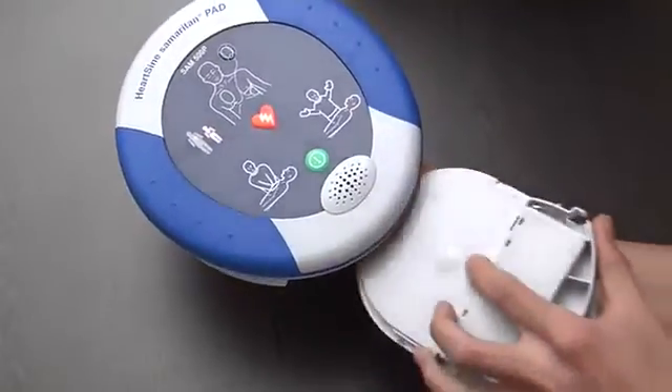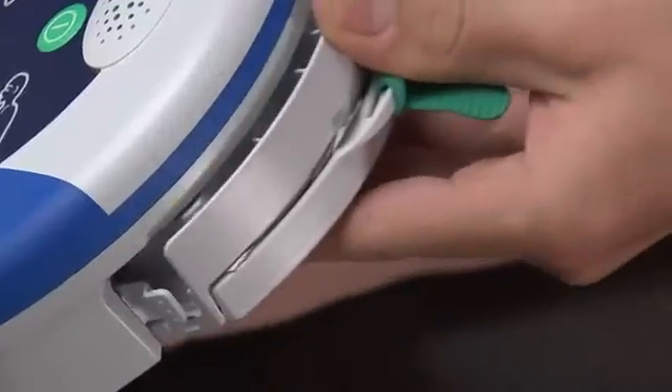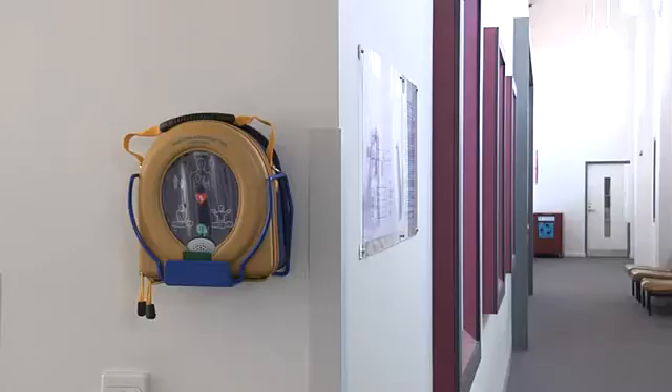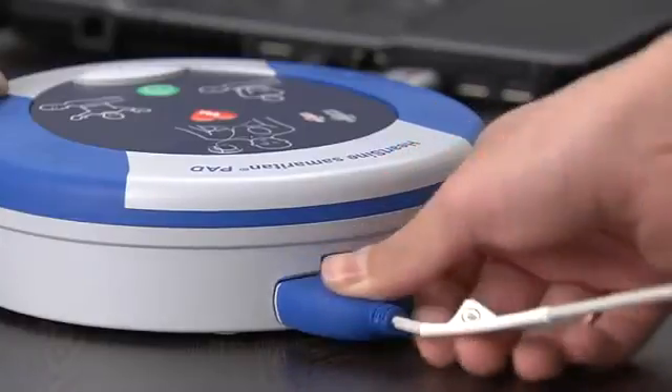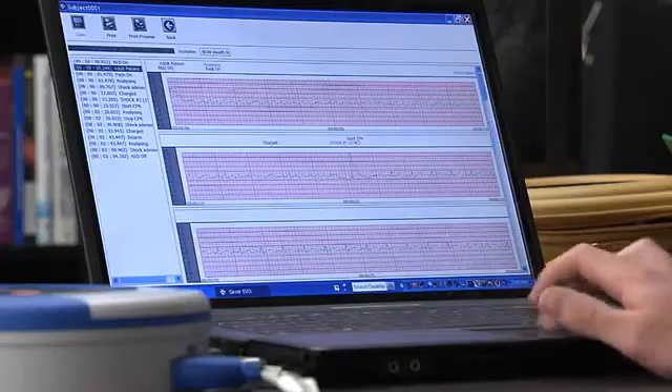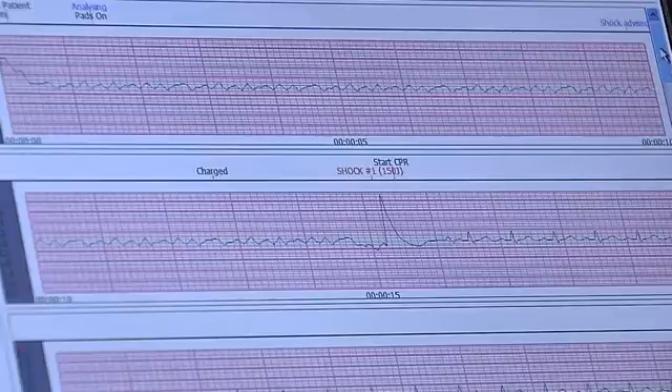After using the AED, the pad pack must be replaced with a new one, then return the AED to its original position. If you have the optional data management package, you can download the recorded event using a cable and the Saver Evo software.